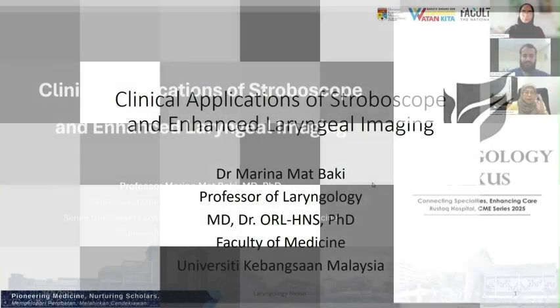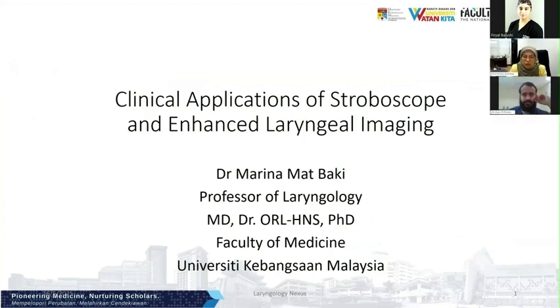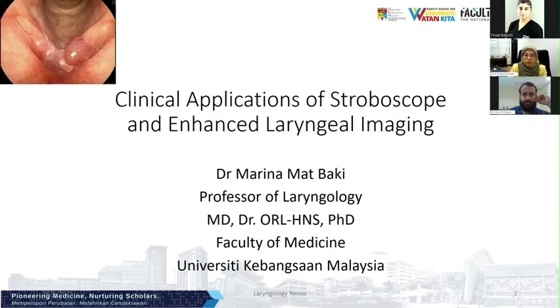The topic given to me by Firial is clinical applications of stroboscope and enhanced laryngeal imaging. So there are two things in here, stroboscope and enhanced laryngeal imaging, which in much of the literature, and if you ask many surgeons, they like to combine those two because it enhances the accuracy of the laryngeal examination, especially when there are lesions on the vocal fold.